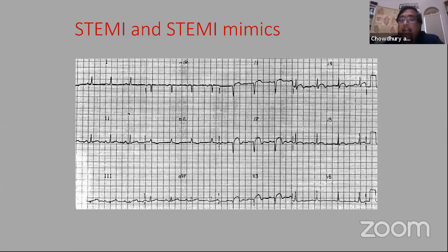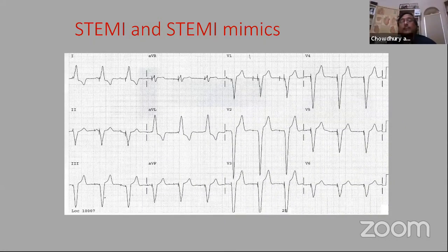But I wanted to ask you about this one. This was actually a tough one. The patient comes in with chest pain, and luckily the patient can talk. Sometimes we see these patients coming intubated and we cannot get anything else. The ER is saying this is STEMI because there is ST elevation in V1, V2, V3, V4. What do we do with this? This is clearly AV paced. Can we interpret anything out of it? Anybody answering?